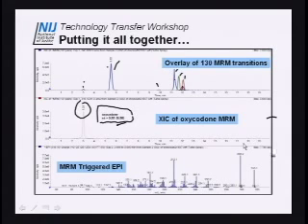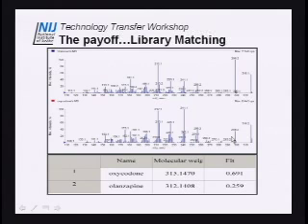So that's what oxycodone looks like as a product ion mass spec. And you can see there's lots and lots of fine ion detail there. Lots and lots of ways for me to say that is oxycodone and feel confident when I skip into court. And they ask me, how do I know? And I say, well, it's obvious. I know it's obvious because I produced a library match. And this is the library that I built in-house using those very standard parameters that I worked so very hard to optimize. And you can see here, this is oxycodone.